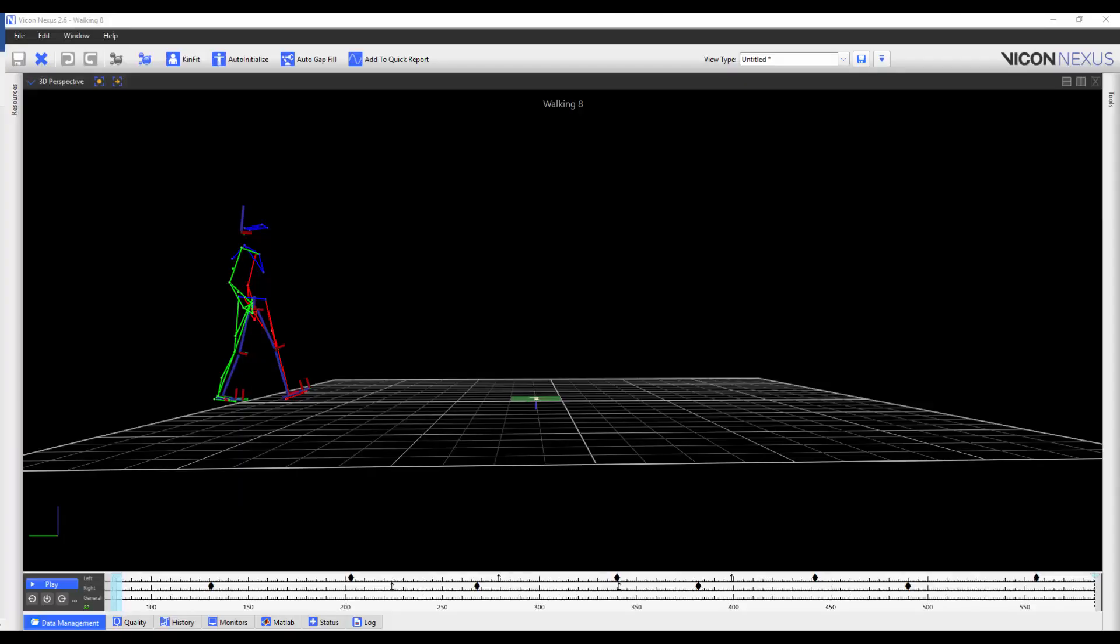When you are in the normal mode, that is, you are not in the event identification mode, you can jump to the next event by pressing the forwards or backwards buttons.